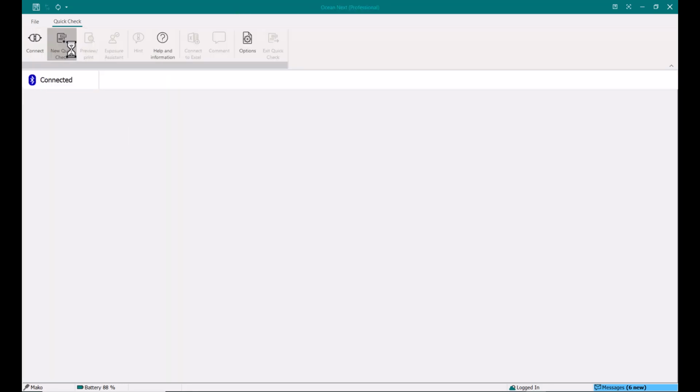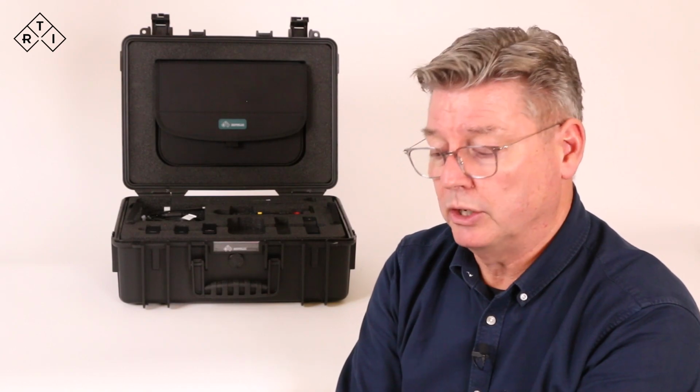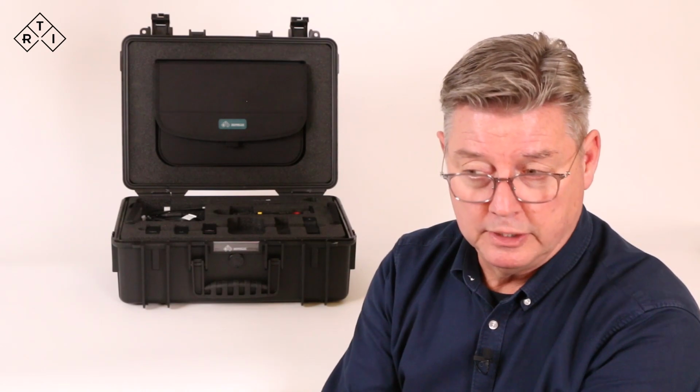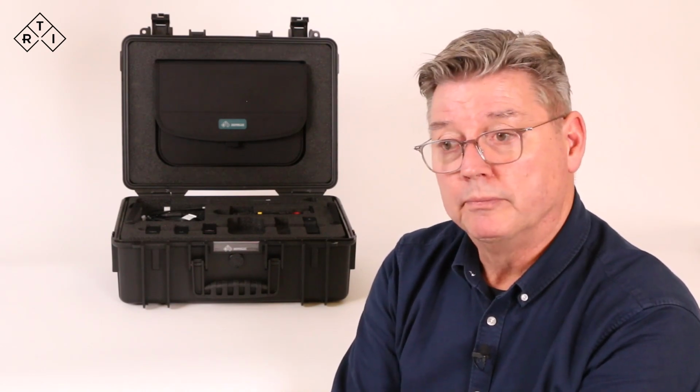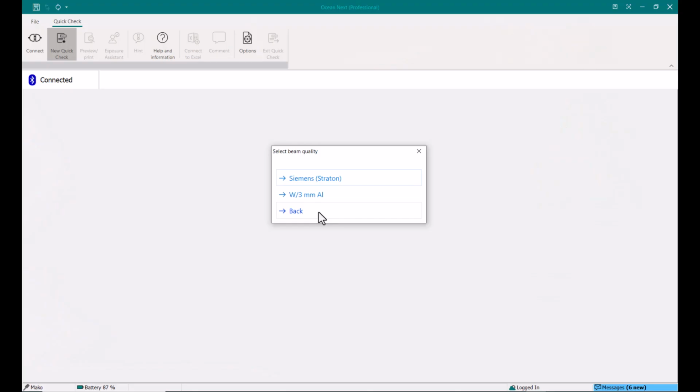If we look at the CT configuration, we have only 2 selections necessary. Tungsten and 3mm aluminum is for the majority of CTs out there in the market. The GE scanners with 7, 10, 10.5 degree anode angles, the Aquilions and the Philips, etc. They are all serviced by that target filter combination. The Straton tubes and Siemens scanners, for now, we left that as a separate selection.